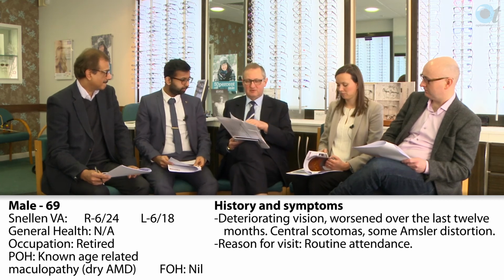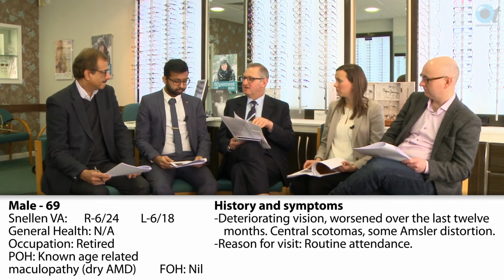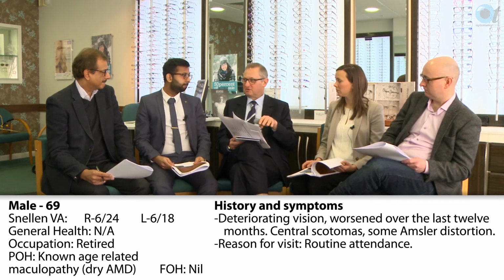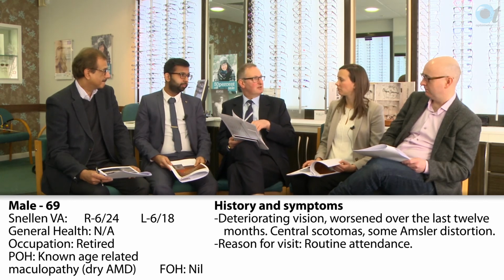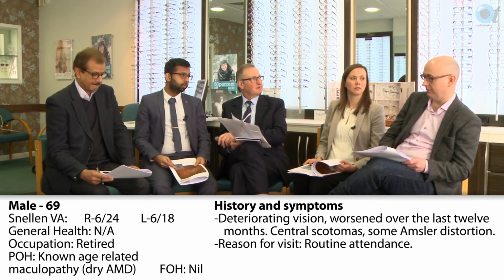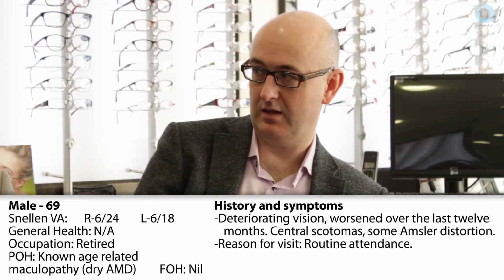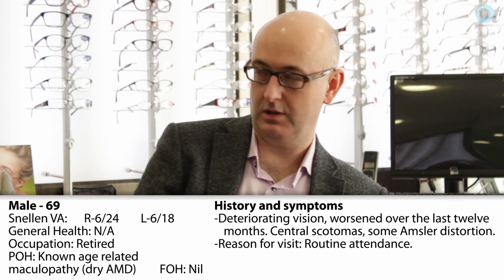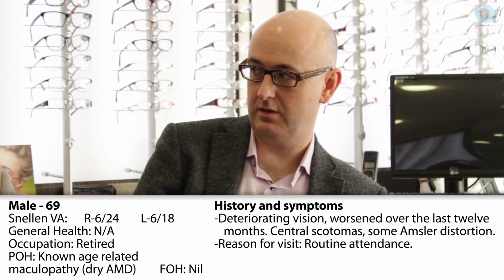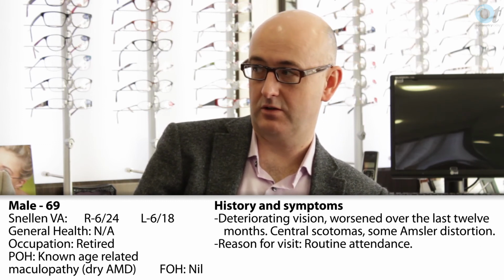But in terms of if you decided you were going to monitor him over the next month or two, would you give him any advice as to what to look out for in case things were changing? What sorts of things might he see? Looking for distortion, so I think giving an Amsler chart for him to take home and monitor, instructing him appropriately on how to do that and how often to do that. And any changes, then he needs to contact the practice immediately, so he can be reviewed for OCT, and then any evidence of wet changes, then they can be fast-tracked.